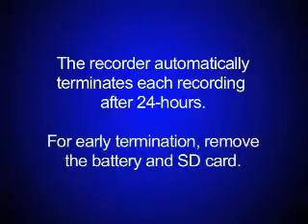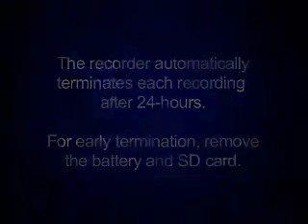The recorder automatically terminates each recording after 24 hours. For early termination of the recording, remove the battery and SD card. A loss of up to 6 minutes of data is normal if the recording is terminated early.